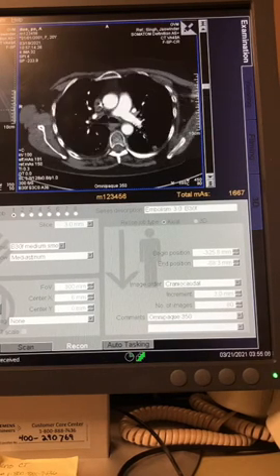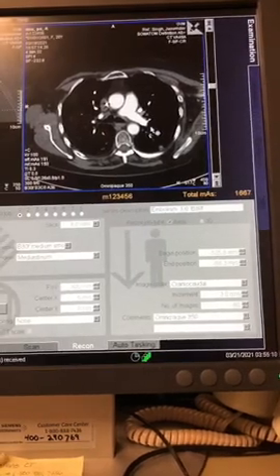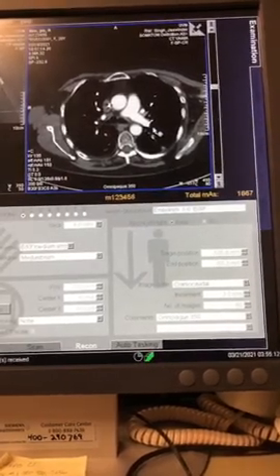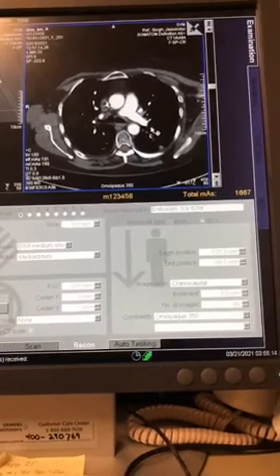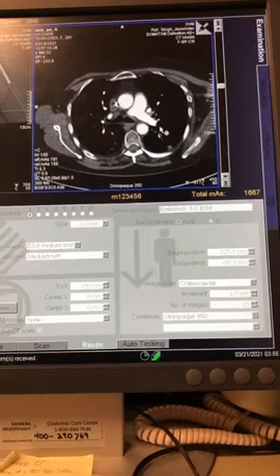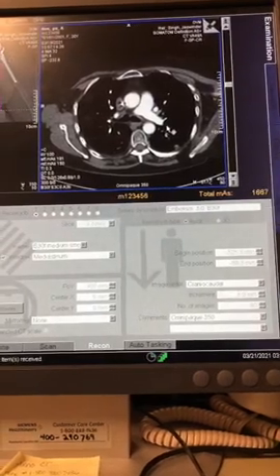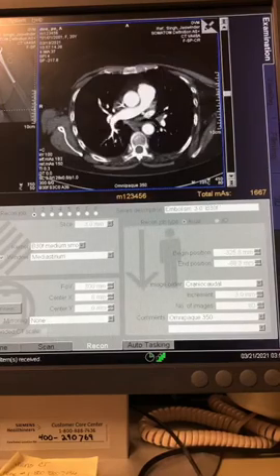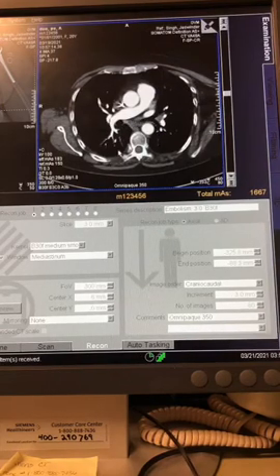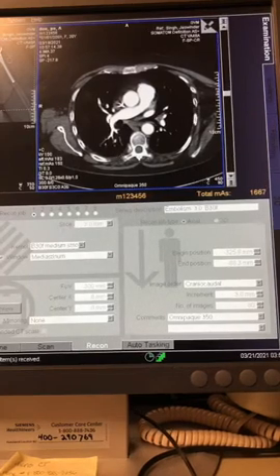I say that to you because a pulmonary embolism, just like a brain bleed, is a critical result. Okay, so if you're working an incredibly busy schedule, say you're doing a ton of outpatients, they order an ER PE, you're like, just another one, man, that's all they do is order them, you're frustrated, like put yourself in that frame of mind and then recognize, oh, and this patient has a PE. If you don't catch that and you just put them back through their regular workflow without contacting your radiologist, that rad may not prioritize it either.